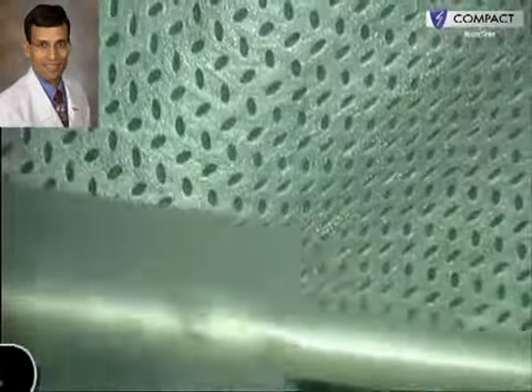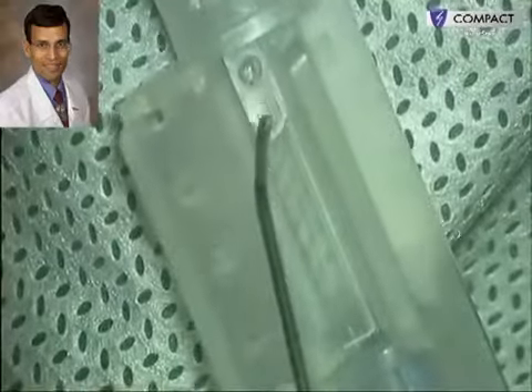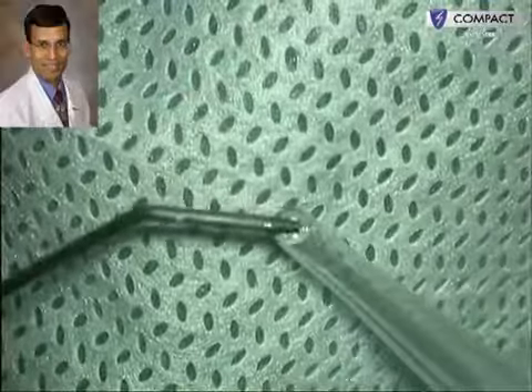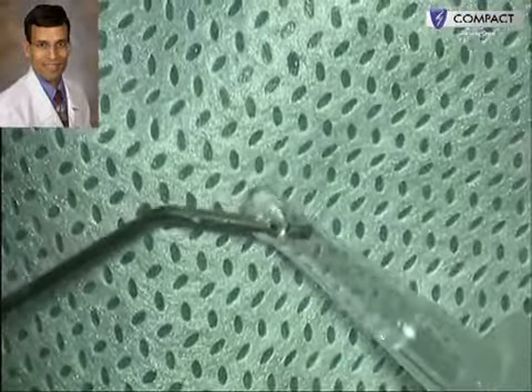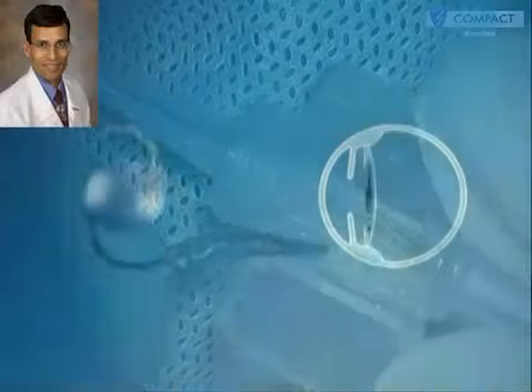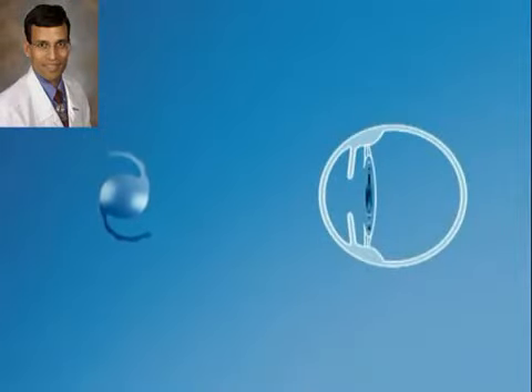Initially a monofocal IOL was implanted because of the possibility of amblyopia, but the patient achieved very good distance vision. Therefore, to achieve spectacle independence, a 0 diopter multifocal IOL with a plus 3.5 diopter add was implanted to provide near vision independence as well. This specifically designed Sulcoflex IOL for the ciliary sulcus has a round edge and undulating haptics which minimize the chances of iris chafing.